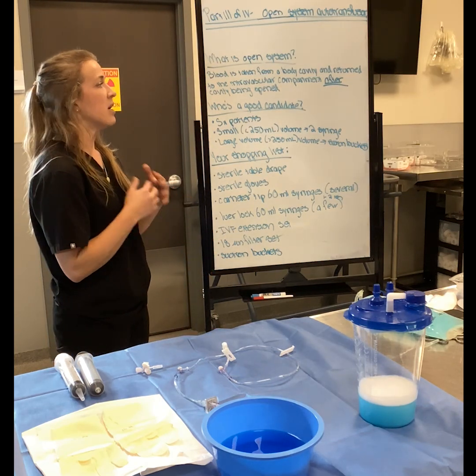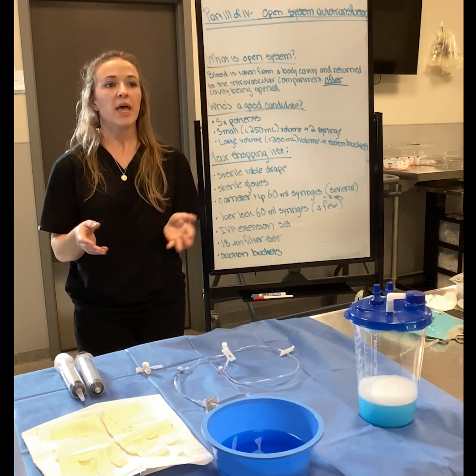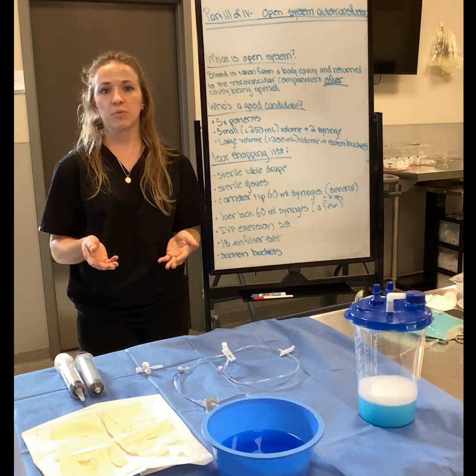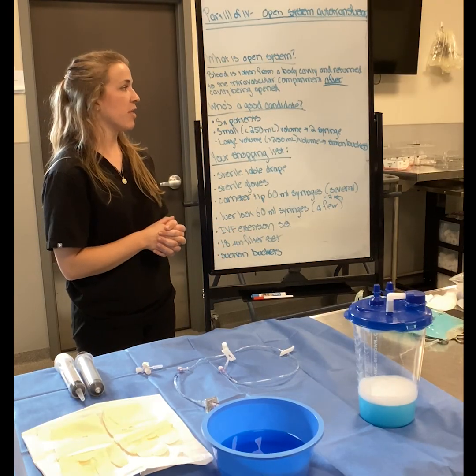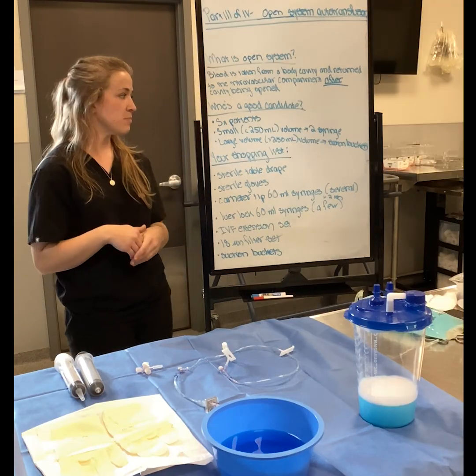So what is it? Open system autotransfusion is when we are taking blood from somewhere and the body cavity is being opened. Usually this is by the surgeon or the doctor you're working with, and we are taking the blood and putting it back into the patient's blood vessels.